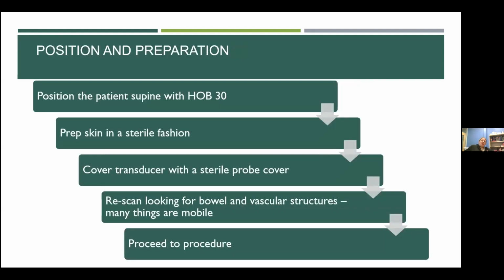Once you've identified the area where you want to stick, I usually mark it with a pen, just to make sure, as the patient moves. But also remember that as you mark, the patient's internal organs will move as well. So you want to make sure that you're rescanning on a regular basis and not doing this in a one-and-done fashion. Typically, put the patient's head of bed up to about 30 degrees.